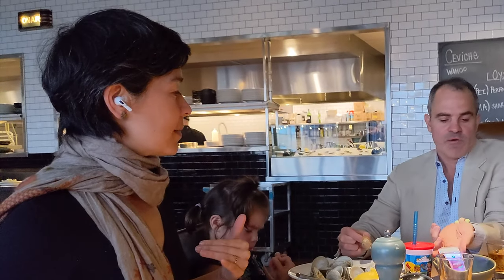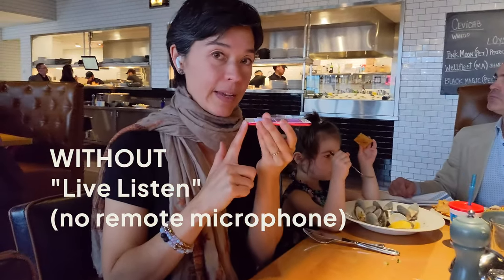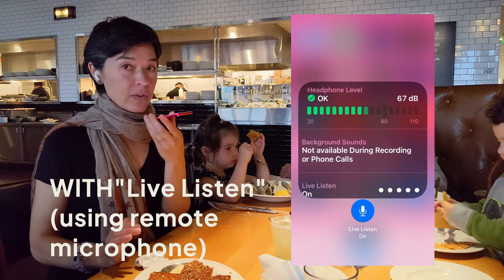This is what it sounds like without using Live Listen as a remote microphone. This is what it sounds like with Live Listen.